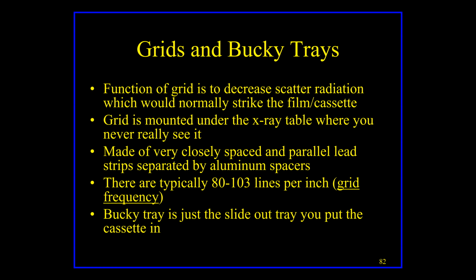If you could clean up, if you will, the scatter radiation, then the image quality of the radiograph is actually going to be much prettier than if not. Okay.